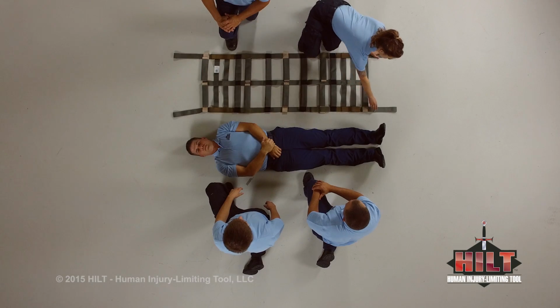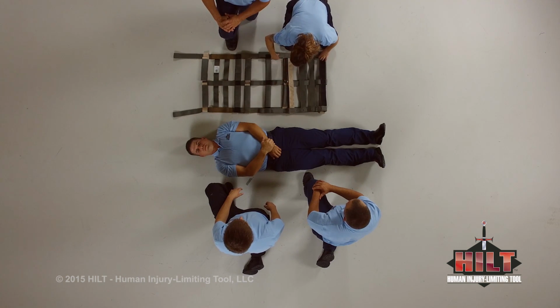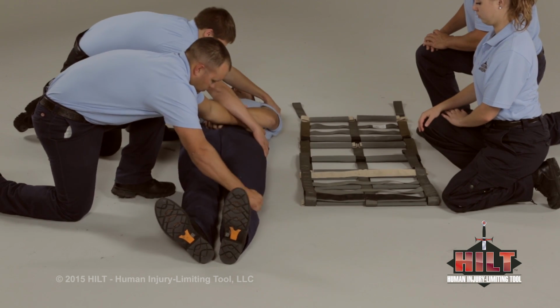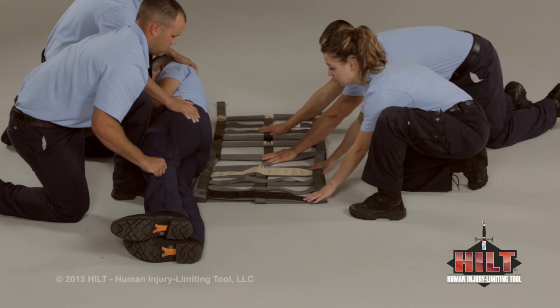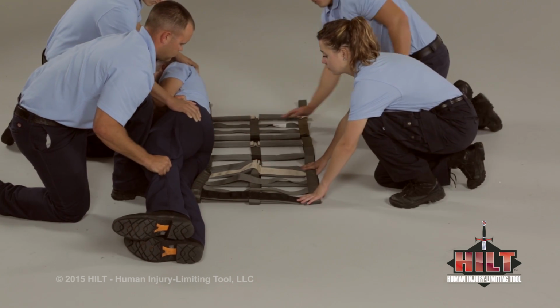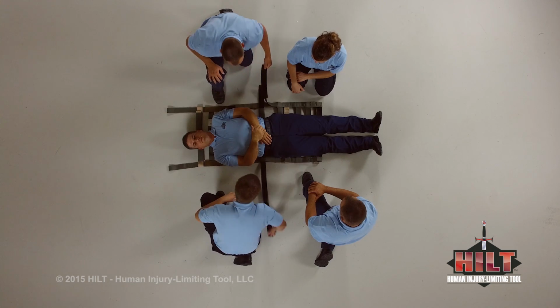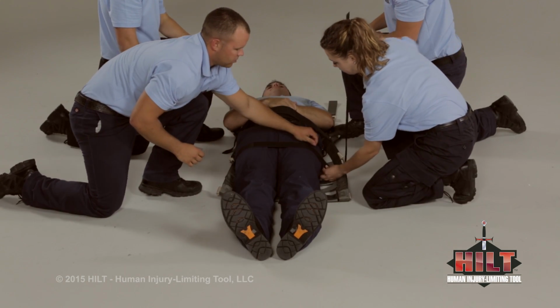To load a patient onto a shortened HILT, fold one end up to the second set of extenders. Shortening the HILT may be desired if the patient is shorter or if setting up for carrying the patient up or downstairs. Log roll the patient and position the HILT's edge just above the patient's knees. Log roll back and center the patient. Deploy safety straps and fasten them around the patient's upper and lower body.